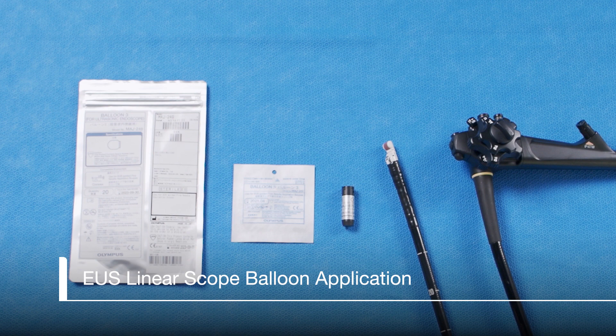This video will review how to put a balloon onto an EUS linear scope. We are using the GF UCT 180 EUS linear scope with a MAJ 675 linear balloon applicator and MAJ 249 linear balloon, but these instructions apply to all curvilinear EUS scopes.